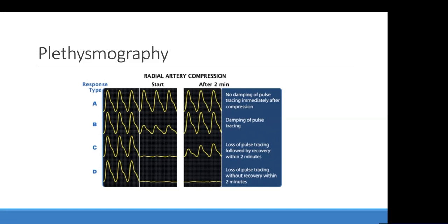I usually don't look into this. I just go ahead. If there is a pulse, I can puncture it without even risk of complication. I've never had a radial complication so far.